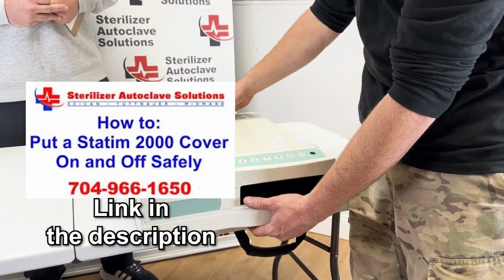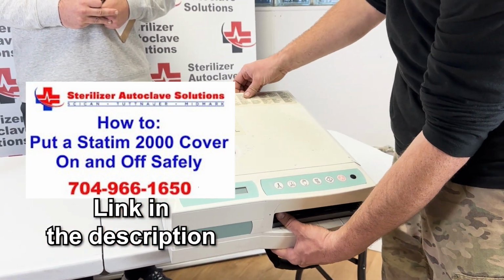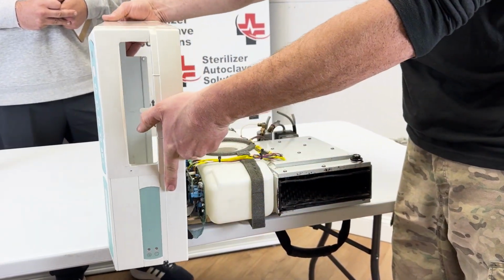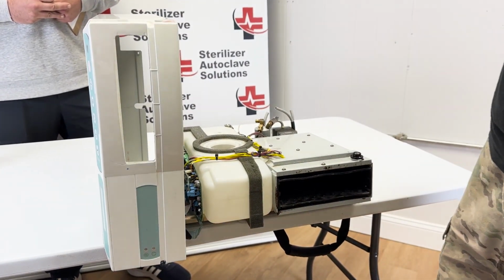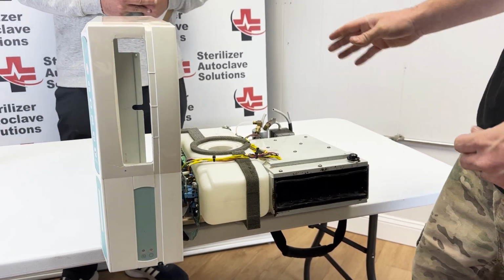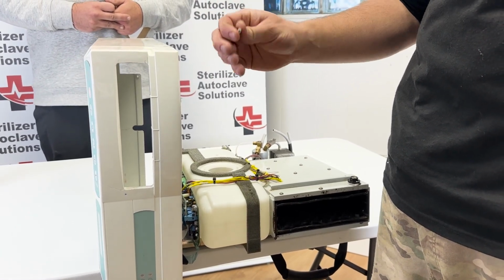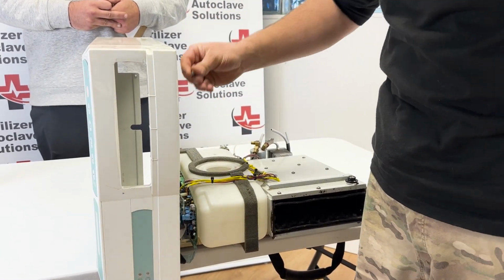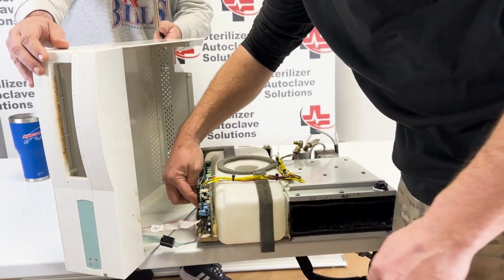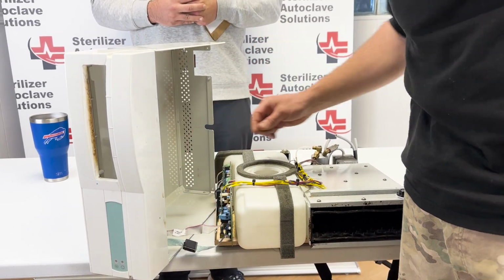So I have all 7 screws removed. I have room on the left side of the unit. I'll lift up on the back, slide the whole top cover forward a little bit, and it will just slide and sit next to the unit like so. Now, with the unit off, what we're going to do is I'm going to use one of the screws that was in this top cover, and I'm going to wedge it between the W1 pin right here. What that does is that completes the circuit.